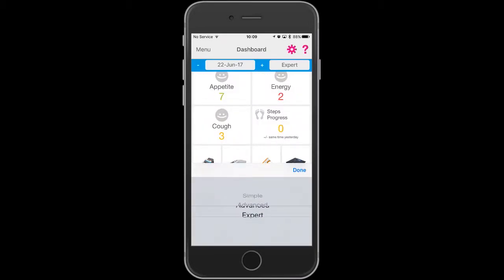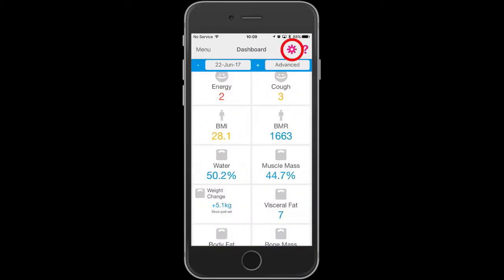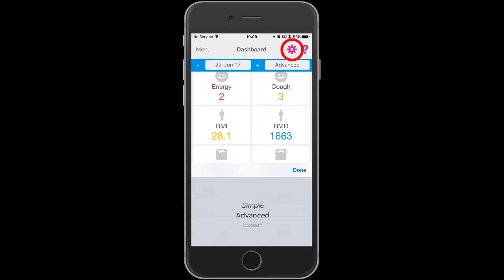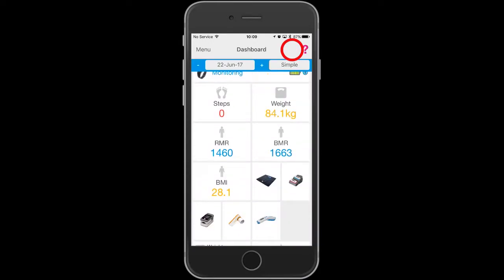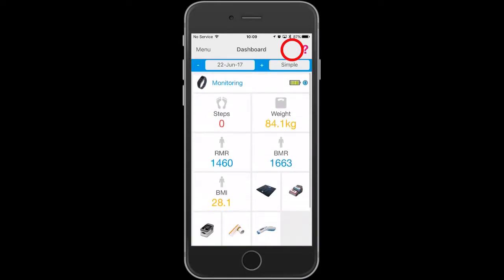You can only add the widget if you are in the expert or advanced dashboard, not in the simple dashboard layout.